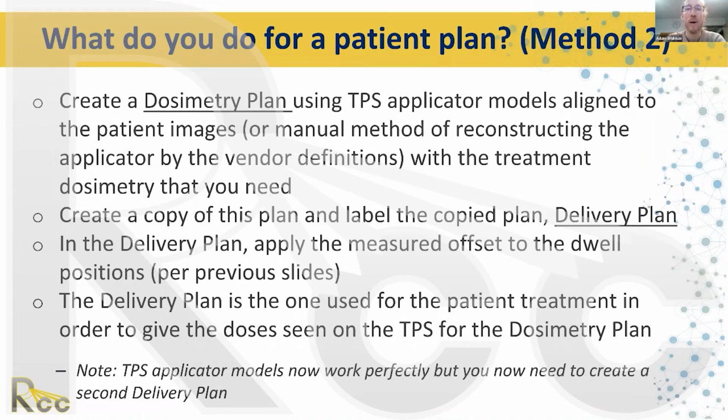So both options are good. Different people have different preferences. Again, choose the method that you want, and important, make sure you verify with film. Plan a delivery of what you think is symmetric loading, deliver it to film and make sure it is symmetric. That's the most important step for whether it's step backwards or step forward rings. Make sure that what you think you're delivering is what you're delivering, because it's complicated.